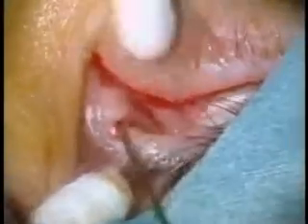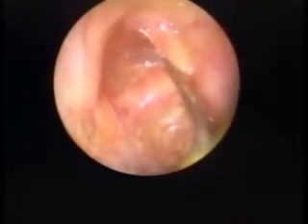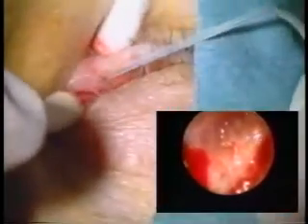This is an obstruction of the membranous nasal lacrimal duct which runs along the temporal wall of the inferior nasal meatus. The metal probe penetrates the membranous nasal lacrimal duct in the inferior nasal meatus.